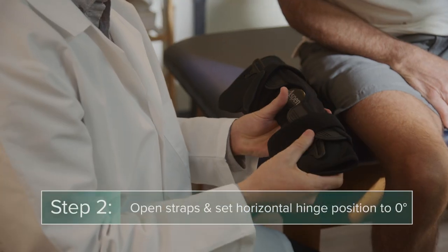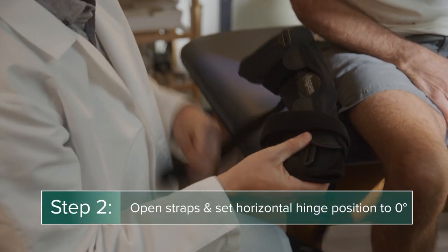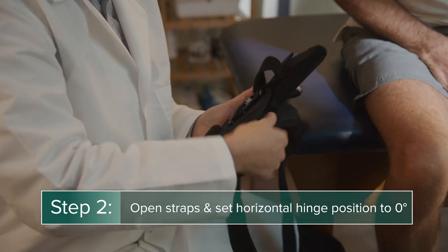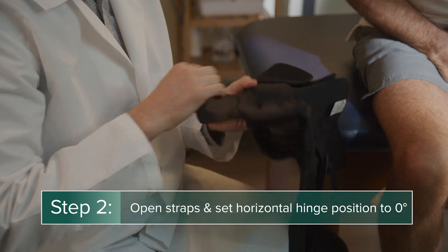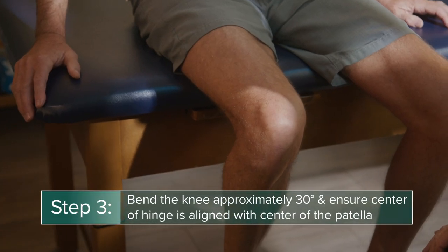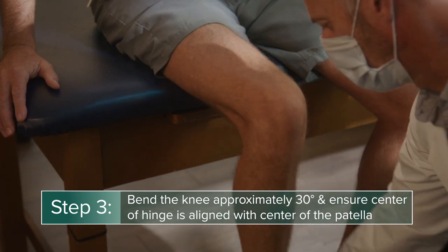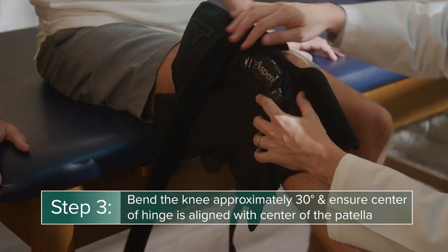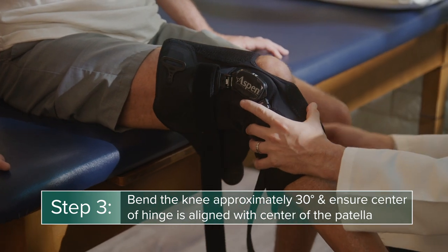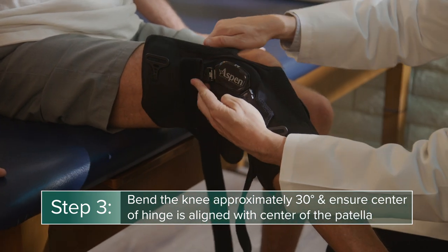To apply the brace, first ensure all straps are open and the horizontal position of the hinge is set to zero degrees. The patient will need to sit with their knee bent at an approximate 30-degree angle for proper placement. Align the brace evenly with the center of the knee, so the center of the hinge is aligned with the center of the patella.